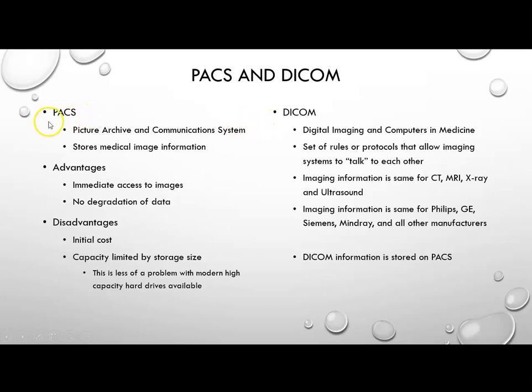So PACS is where the pictures are stored, and they get there by DICOM. So DICOM comes in, talks to your system, and collects the information and sends it to PACS. On PACS, all the DICOM information is then stored.